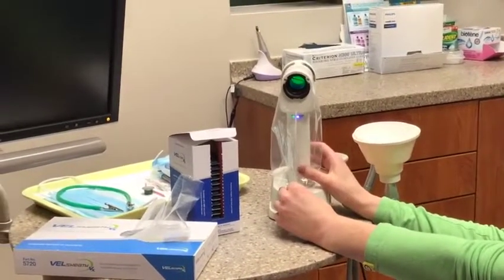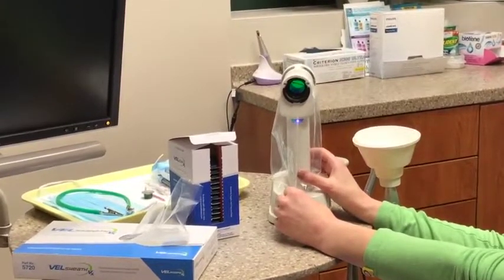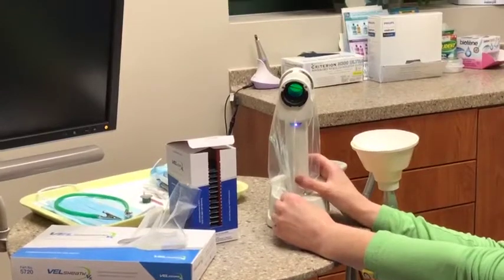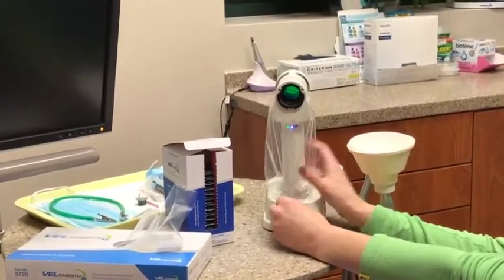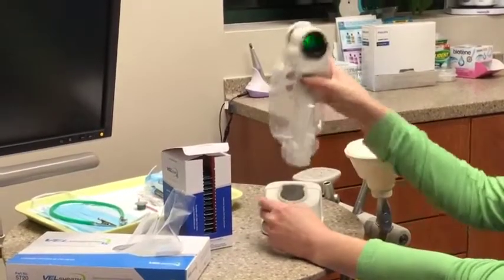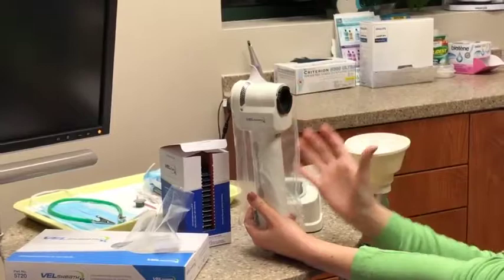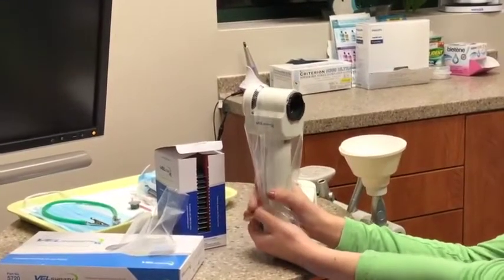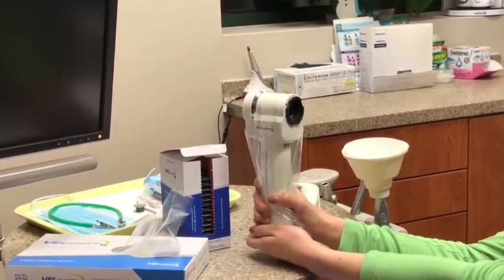The most important thing about this is it is a one-time use sheath. You're not going to use this for more than one patient — it's simply for one patient and then you're going to toss it. The great thing about this sheath is that it allows proper ventilation within the machine. This is a very high-powered machine so you want to make sure it is properly ventilated so it does not break down. It will also prevent any type of cross-contamination within the operatory.